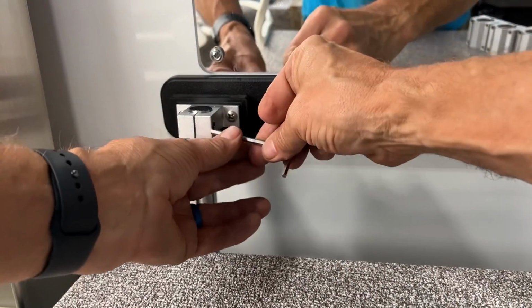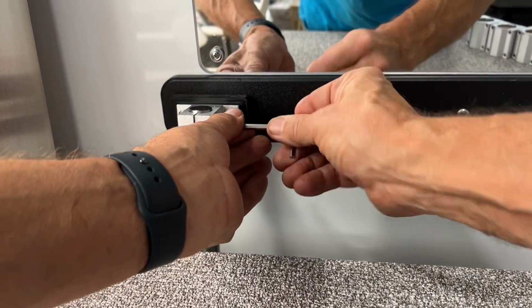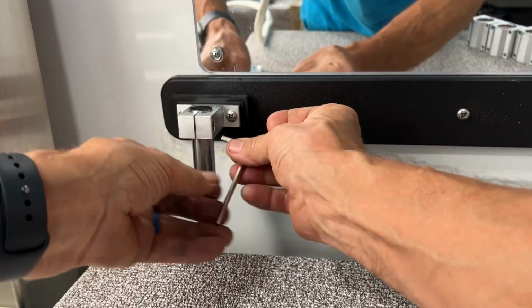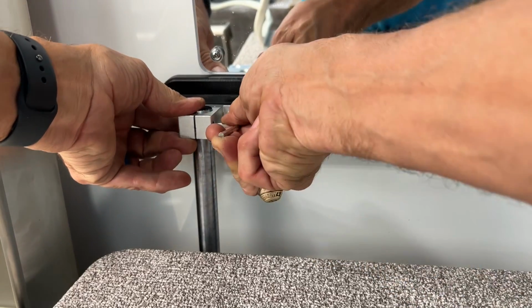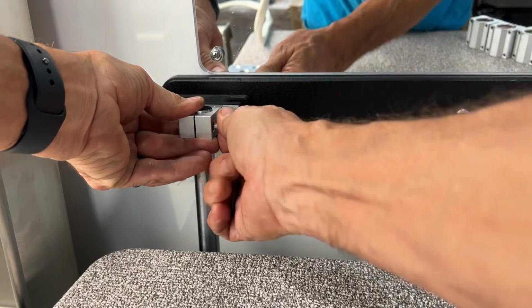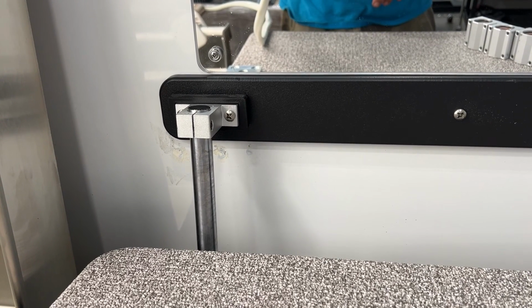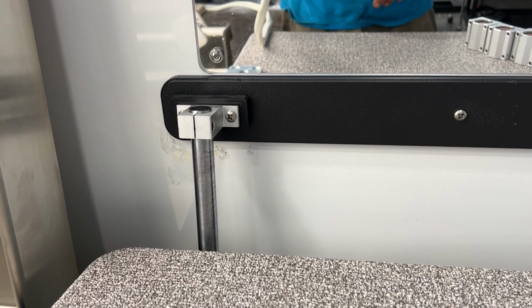Okay, now grab your Allen wrench and tighten the top bracket set screw. It's easier to turn it using the long end first, and then when you get ready to tighten it, use the short end into the head. Make sure it's nice and snug, but don't over tighten it. Now repeat this process on the right hand rails.